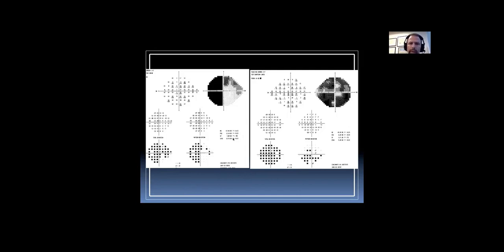Is there any difference between the Humphrey visual field and frequency doubling? I look at frequency doubling as faster. It's more of a screening test. There have been papers out there, and I have definitely seen screening frequency doubling tests where it looked like there's some obvious neurologic defect, and when you repeat it with Humphrey fields with full threshold testing, it goes away. So if I were to find something with frequency doubling, I would repeat it before I order an expensive imaging study.